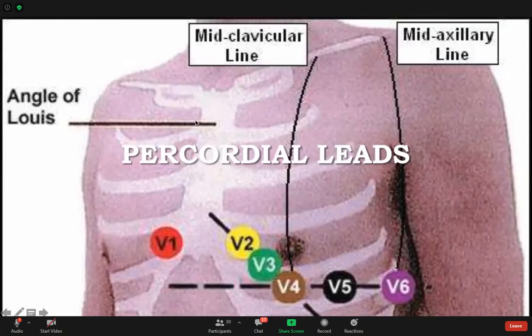في أحد ثاني يبغى يتبرع؟ في كان يوسف he wanted to talk. اي هلا دكتور موجود. يلا go for it. Okay, 12 lead. We attach one in the right arm and lead 2 in the left arm. And لا lead 3. لا كذا you understand it wrong. هي electrodes ما هي lead صح ولا لا؟ صح. ايه فأنت you attach electrode to your right arm. فهمت؟ This is the first part. And then I don't see myself للأسف. خلينا نشوف هل أنا طالع في الكاميرا ولا لا. Anyways. Okay. So you attach yourself.